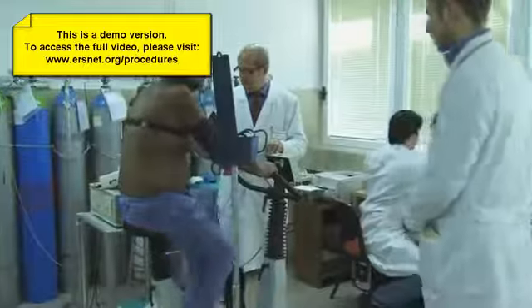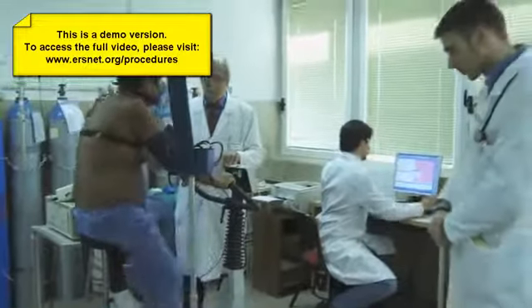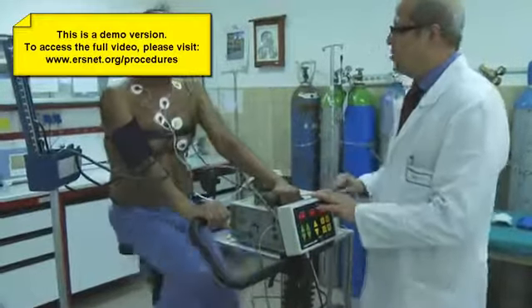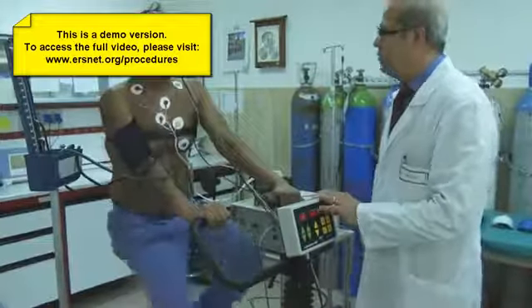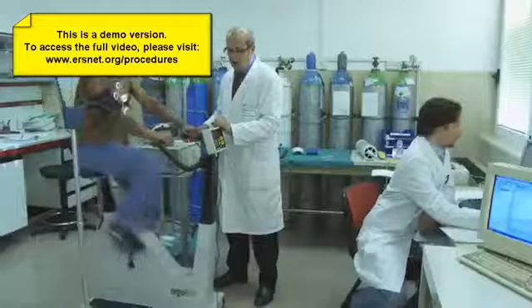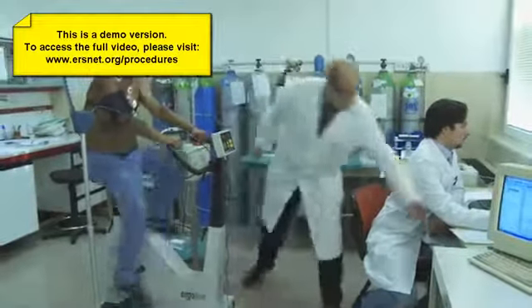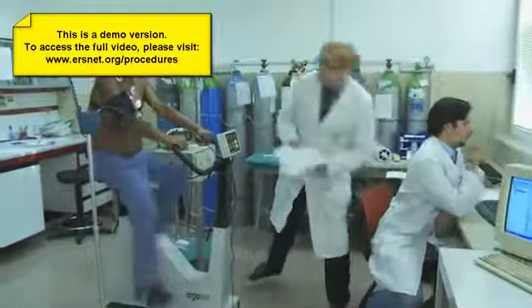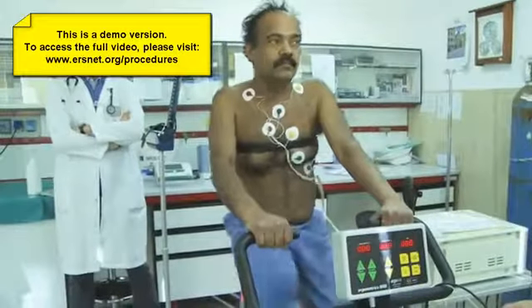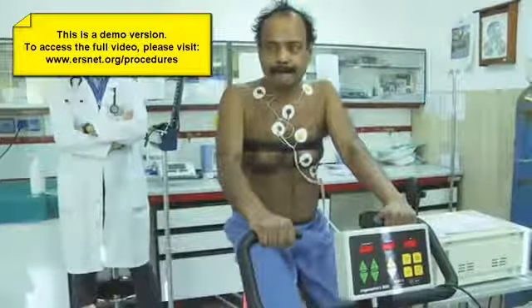Two modes of exercise are commonly employed in CPET: treadmill and cycle ergometer. There are several advantages to using the cycle ergometer — it is generally cheaper, requires less space than a treadmill, and most importantly, the rate at which external work is performed is much more easily quantitated.